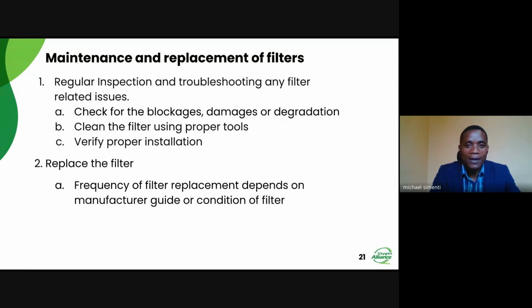And again, if we have found any issues, we have to clean those filters. If we see that the filter is blocked, or dirty, or the filter's condition is not okay, you need to clean it. But you have to use the right tools. If we follow the guidelines or recommendations from the manufacturer, we'll be able to follow the right procedure on how to clean those filters. Some filters can be cleaned using soap and water. We can wash them. Some other filters, you just need to blow them using compressed air. To those having PSA plants, for the gross particle filter, just use compressed air right there, or you can use the blower itself.